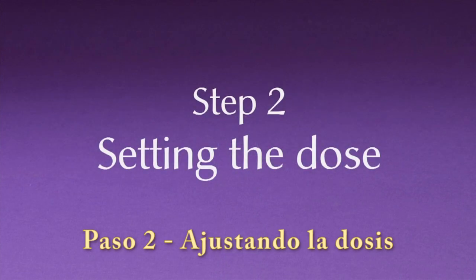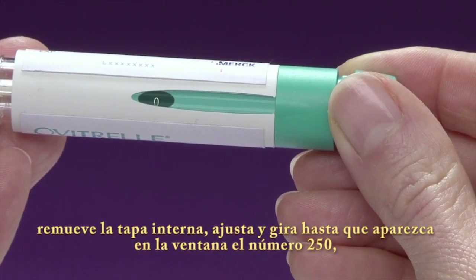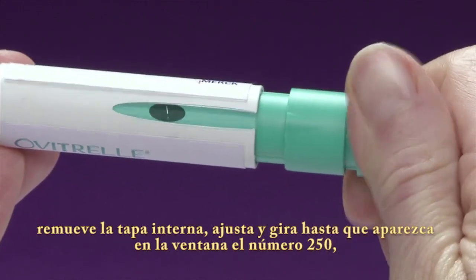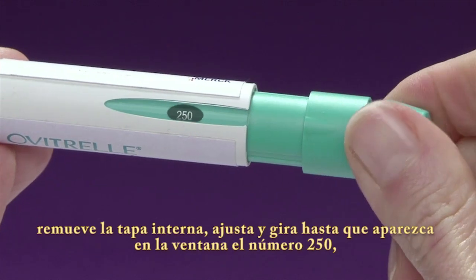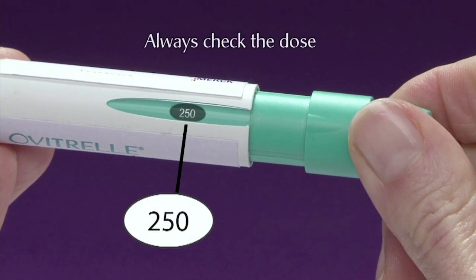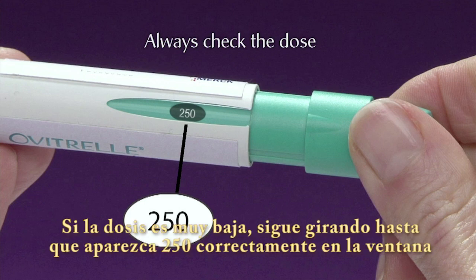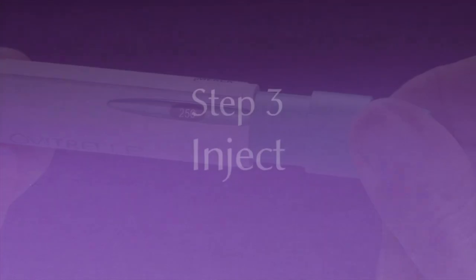Step 2. Setting the dose. If you have not yet done so, remove the inner cap of the needle. Turn the dose setting knob until 250 appears in the dose window on the side of the pen. Please do not push or pull the dose setting knob while you turn it. Always check that the number showing in the dose window is 250. If the dose you dialed is too low, turn the dose setting knob again until you see 250 showing correctly in the dose window.